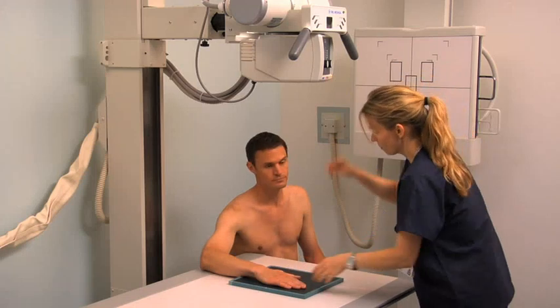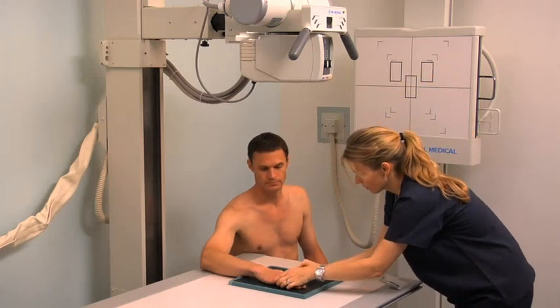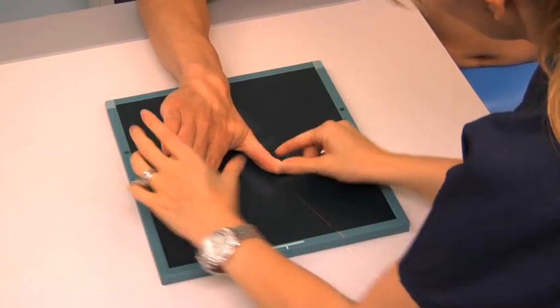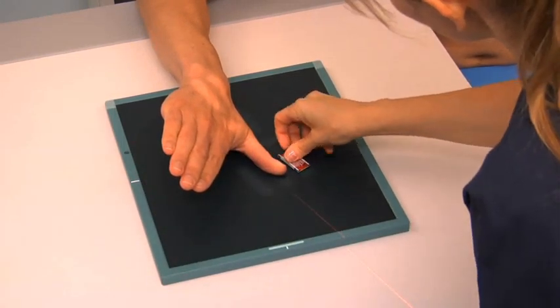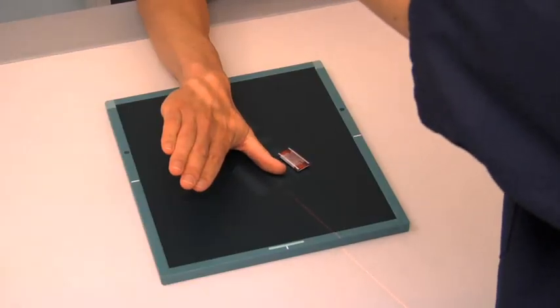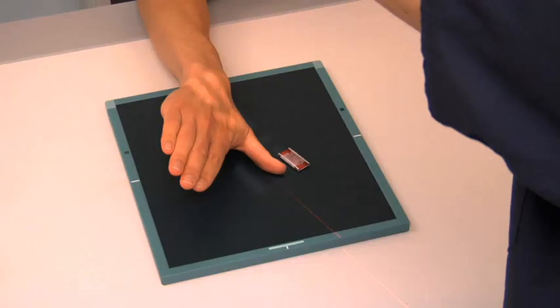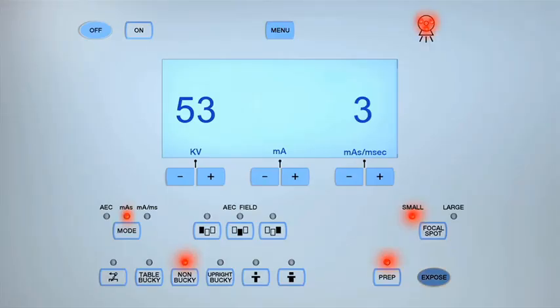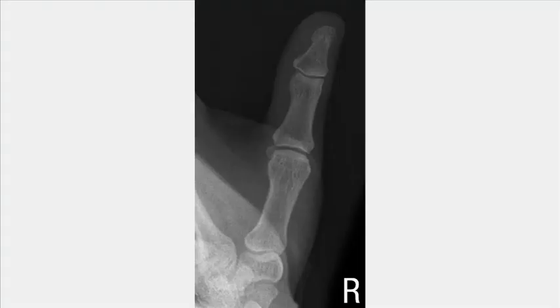To obtain a lateral projection of the thumb, extend the patient's forearm and pronate their hand. Abduct the thumb and flex the other fingers to bring the lateral aspect of the thumb in contact with the cassette. Center the central ray to the MCP joint. Collimate the light field the same as for the AP thumb projection and expose the cassette. Review the images from the three projections.